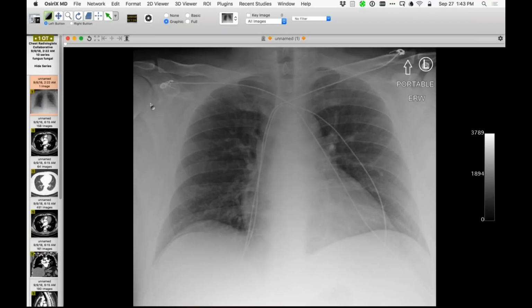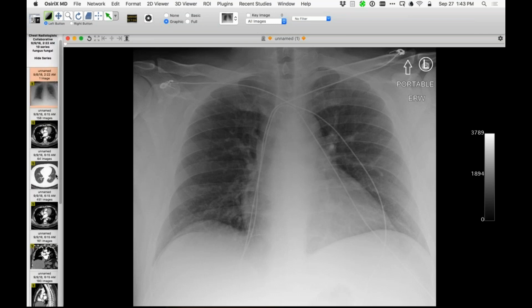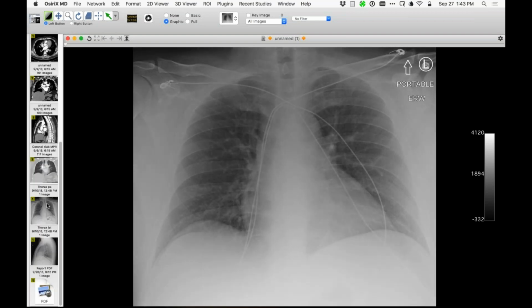Well, here's a nice companion case, because there seems to be a certain theme here today. So let me show you a bedside radiograph, and then I'm going to show you frontal and lateral projections that were obtained a little bit later. So I came across this case in the context of reading a CTPA that was done for chest pain, for pulmonary embolism. And this will be illustrative of 2 things. One is what I call a hidden lesion. So stare at that for a moment. Of course, it's a bedside radiograph, and I'm certain you won't see anything.